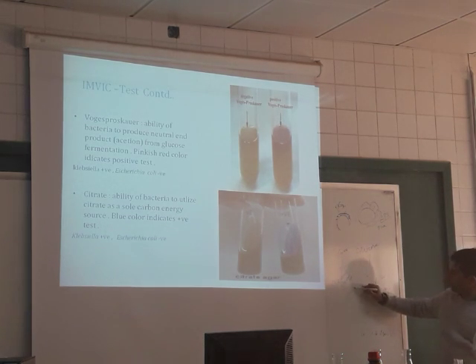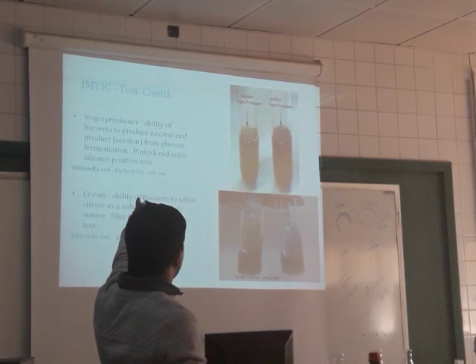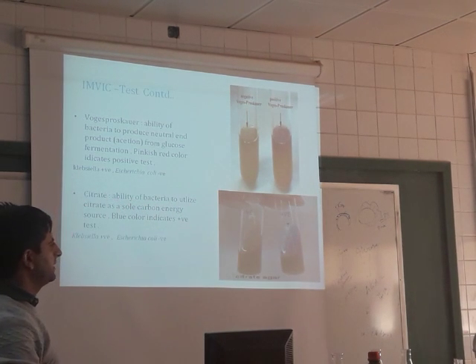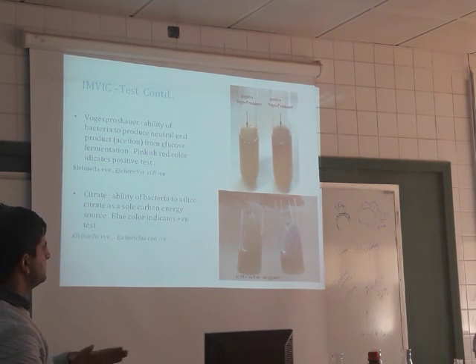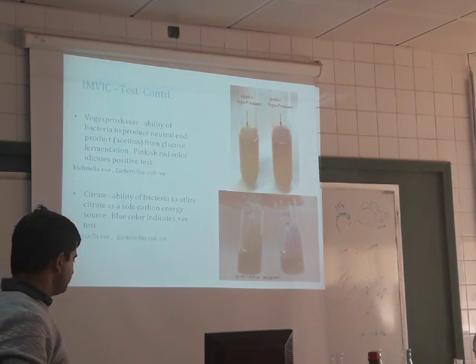Citrate, blue in color. Okay? Fine? How is this one? Which one? What is the name of it? This is the Voges-Proskauer test. This is the name of the test, not the name of the gap.